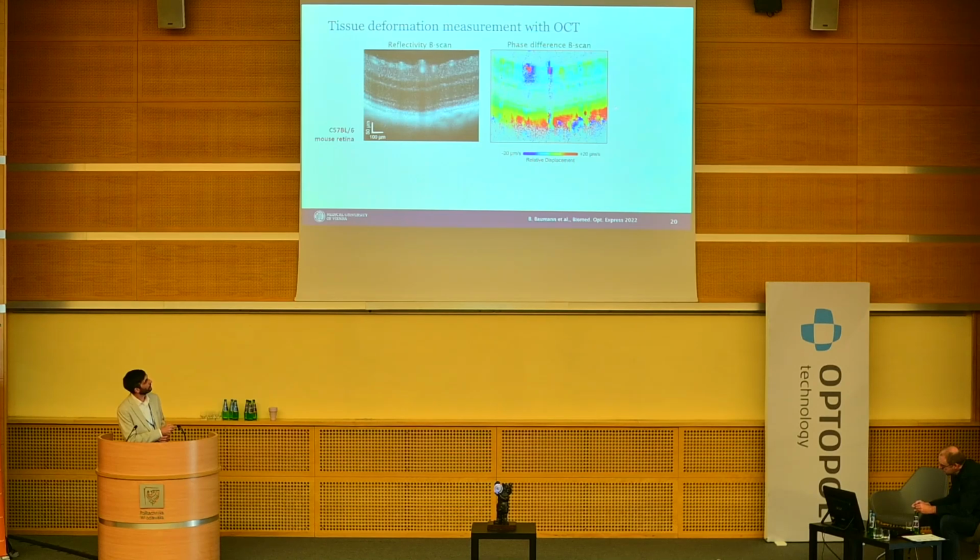You see here in the choroid a lot of displacement, but also around the larger retinal vessels we see not only the vessels, but around the vessels the tissue is being displaced. And if we do this not just between two images, but between a series of images, here, for example, we acquired 2,000 images, over time we see this periodic pattern appearing as the blood is pumping pulsatilely through the retinal and choroidal vessels.